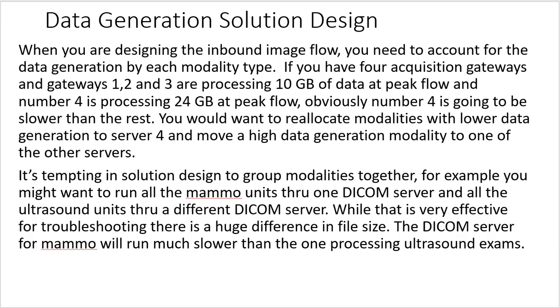It's tempting in solution design to group modalities together. For example, you might want to run all the mammo units through one DICOM server and all the ultrasound units through a different DICOM server. And while that's very effective for troubleshooting, there's a huge difference in file size. The DICOM server for mammo will run much slower than the one processing ultrasound exams.